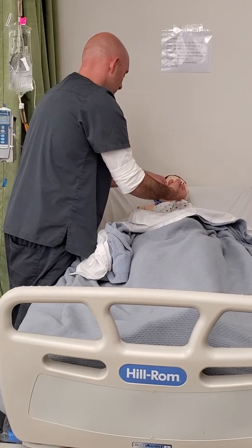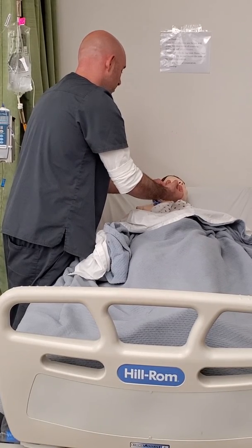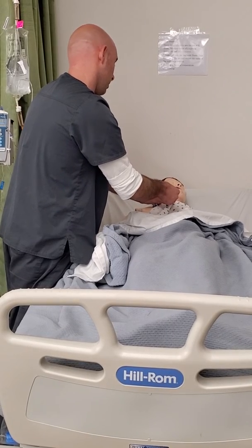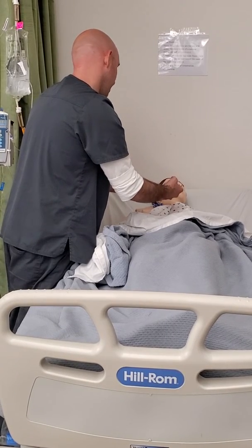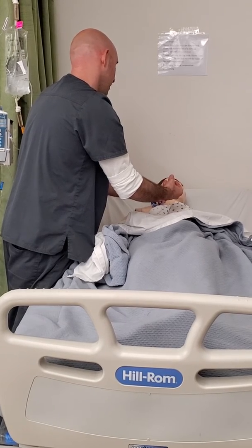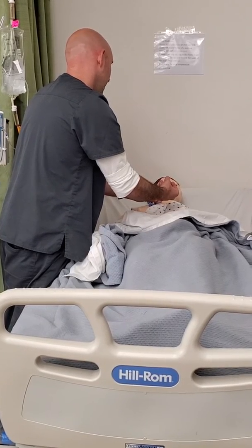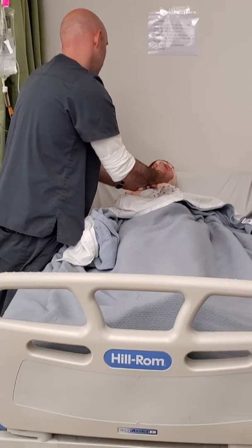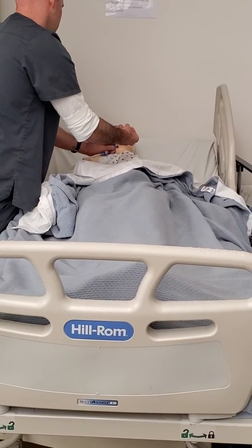Were you still push pausing? I push pause in the beginning, and then push, pause the whole way through because you want to keep that cleaned out. Okay, so I'm gonna push pause throughout the infusion of the normal saline, and then once I empty the saline, then I'm going to lock this. And why are you keeping positive pressure?